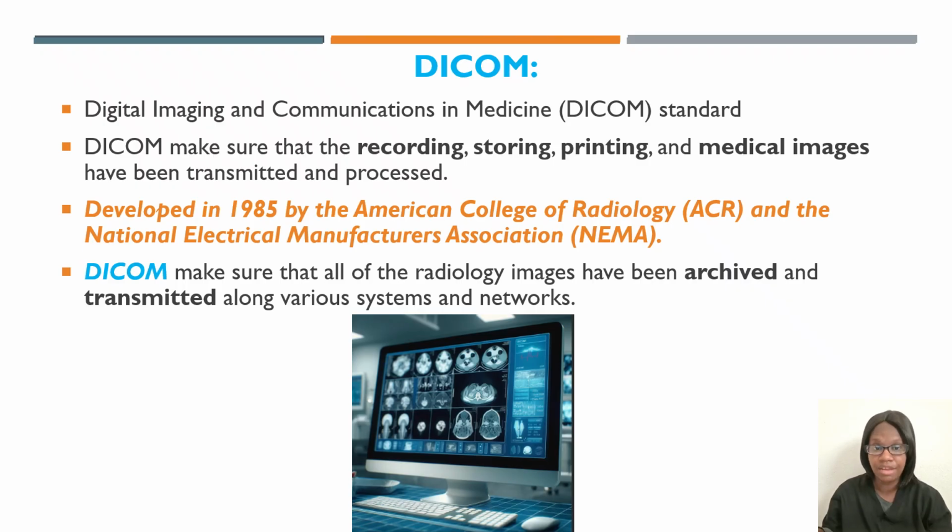Developed in 1985 by the American College of Radiology, also known as ACR, and the National Electrical Manufacturers Association, or NEMA. So DICOM does make sure that all of the radiology images have been archived and transmitted along several and various networks and systems. If you don't know what archive means, I'll go over it in the next slide or two.